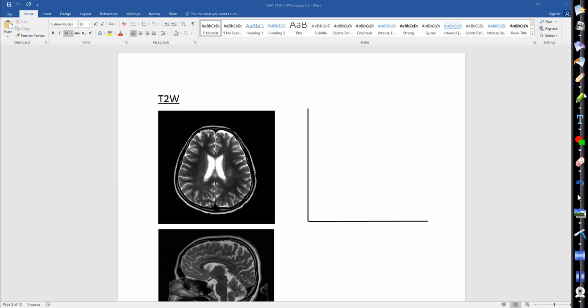So you tell me how to label this. What is this y-axis here? Okay, and so x, y, all right. And then what is our x-axis? Time. And that's in milliseconds. All right. And then let's label or title this graph, and what are we going to call it?